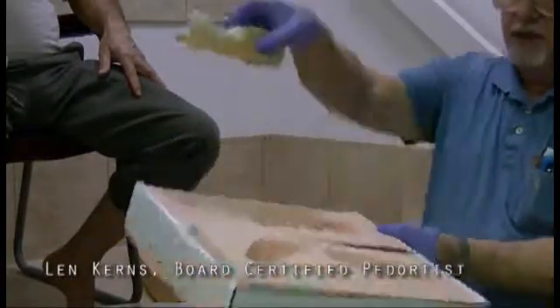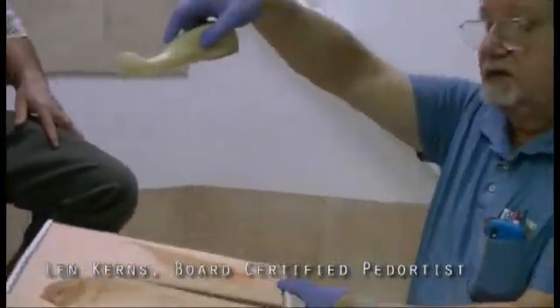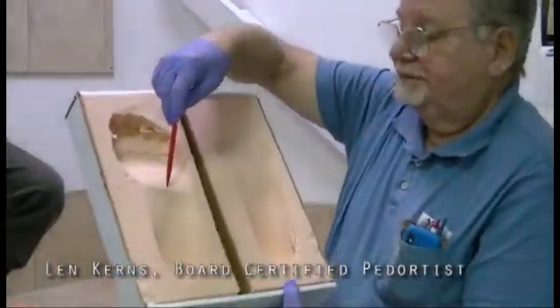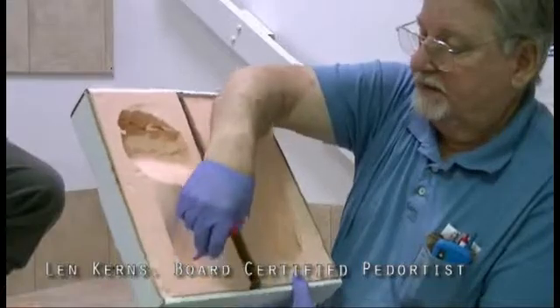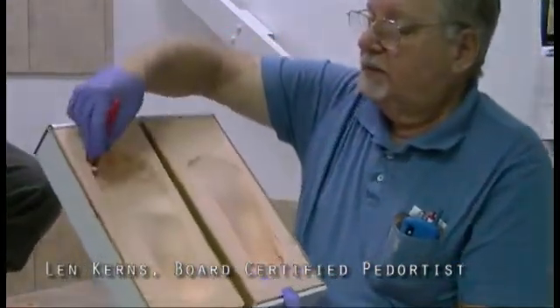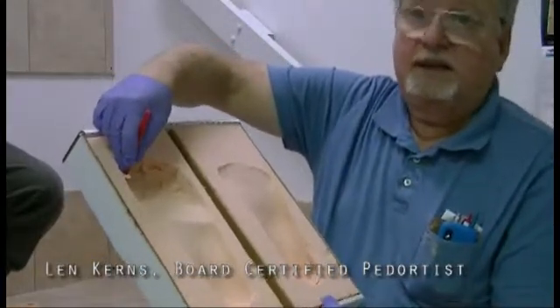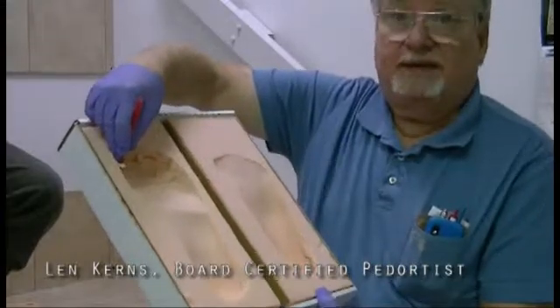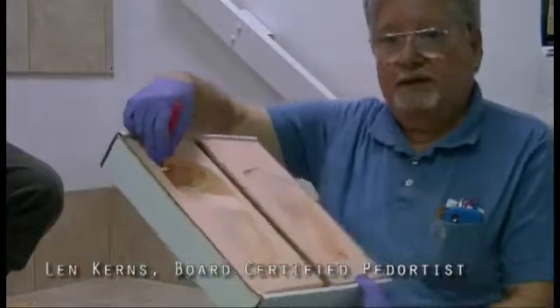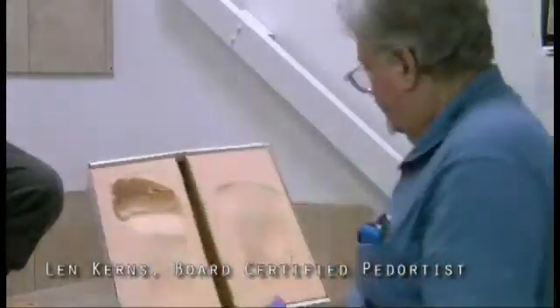But if it was a normal patient, the foot would be level. And I have to see it in the lab to do the cast work. Or in demo number 2, I'd have the heel only halfway down. They would leave the arch not even in the foam and maybe push the toes down, also pronating and supinating it. So how can I do my job correct? So you have to take a look at the cast. It's very important. And when you use this machine, you'll see how easy it is to get the cast properly.